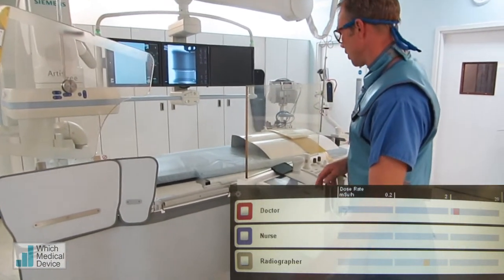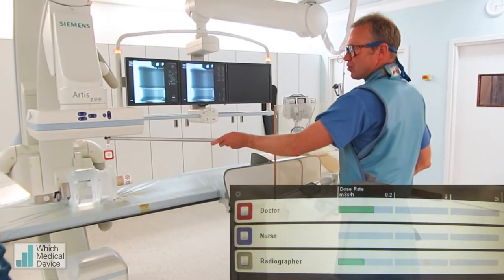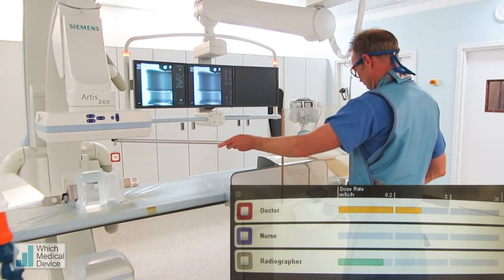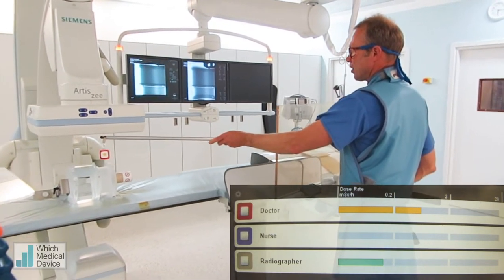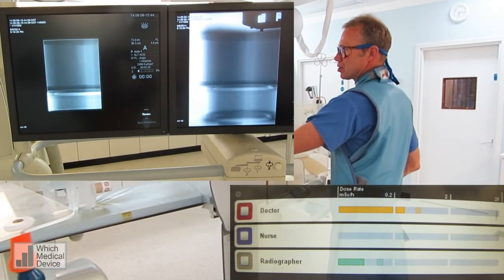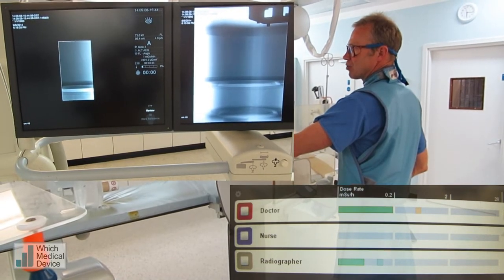The other things we can do to decrease our radiation dose — coning in. We're just going to be screening and having the badge at about waist or chest height again. Now as I reduce the area of radiation, you can see that dose is going to dramatically drop right down into the green again.